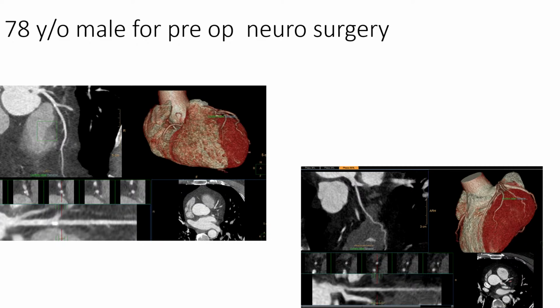So if the patient is breathing 12 to 14 per minute, so each breathing cycle is about 4 or 5 seconds, correct? If we can image the heart in 250 milliseconds, if you're lucky, most of the time you have good odds of catching the patient before they breathe in, breathe out.